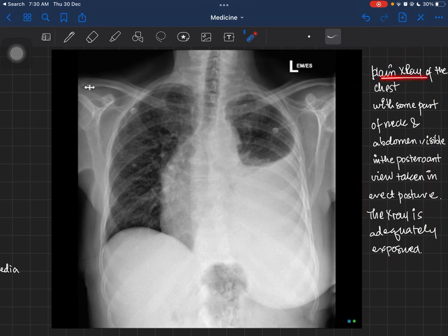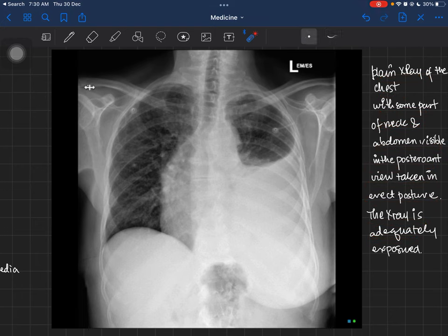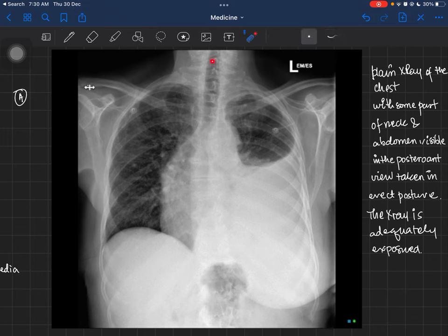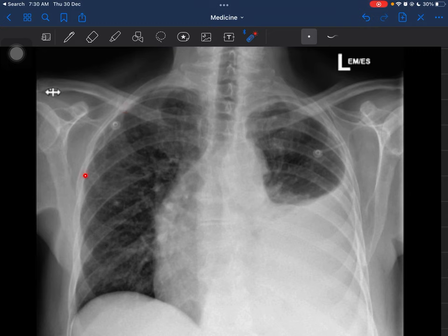So to summarize so far: this is a plain X-ray of the chest with some part of the neck and abdomen visible, in the posterior-anterior view, taken in erect posture, adequately exposed and likely non-rotated. Now for the ABCD approach — A for Airways: you can see the trachea overlying the vertebral spinous processes, and at a certain point it has bifurcated. The right lung fields show normal bronchopulmonary markings, with no collapse or consolidation evident.